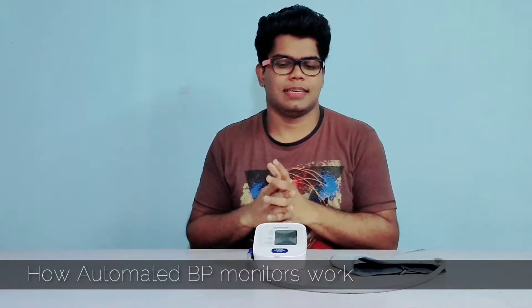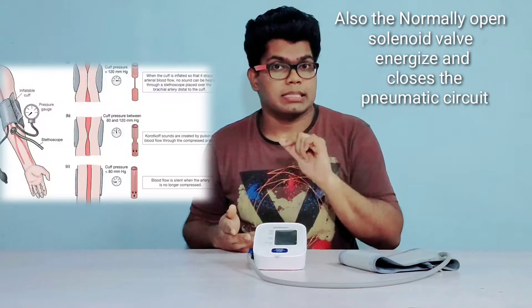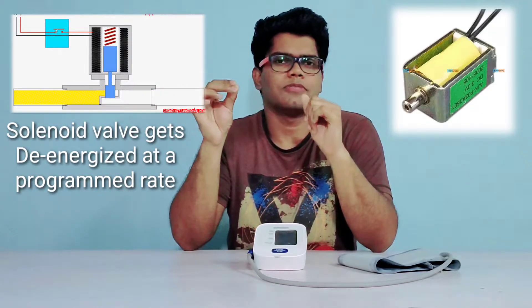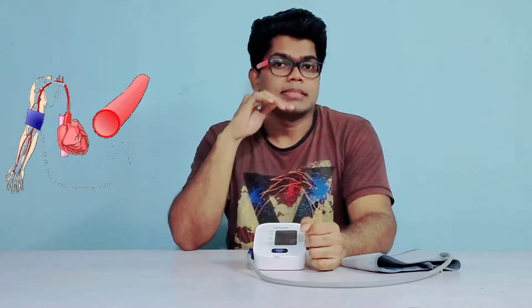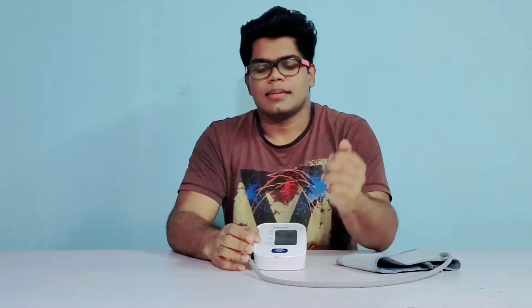When you press the start button, the fuzzy logic program starts running in its microcontroller. It commands the DC motor driven diaphragm pump to inflate the arm cuff to a pressure of 20 mmHg higher than your systolic blood pressure. At that pressure, the arteries get compressed completely and no blood flow happens. Then the deflation process starts — the solenoid valve opens and releases the air at the rate of 4 mmHg per second. When the cuff pressure falls just below your systolic pressure, your artery tends to contract and relax and blood starts flowing, causing pulsating vibrations transferred through the air inside the cuff to the onboard pressure sensor.